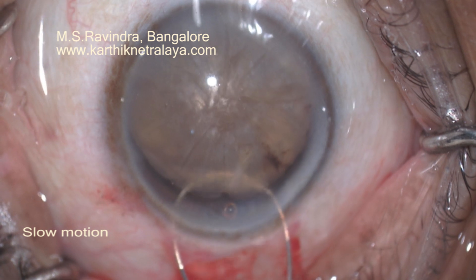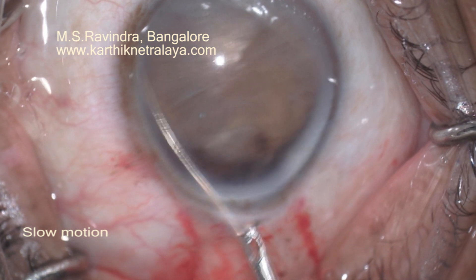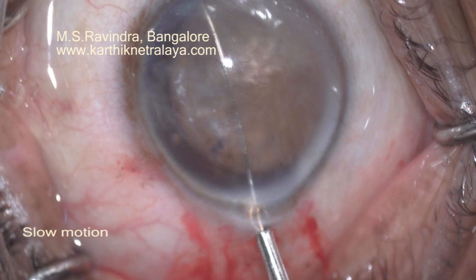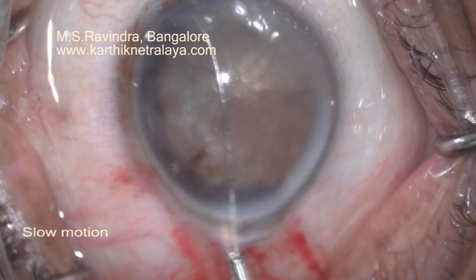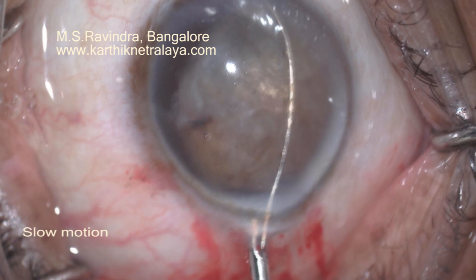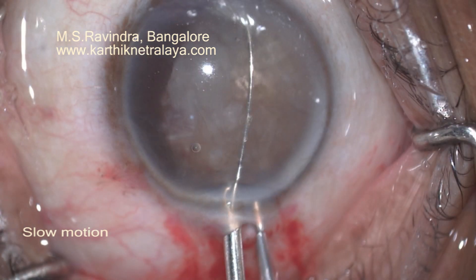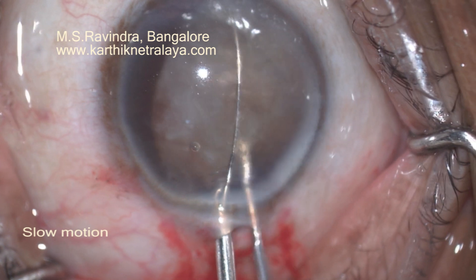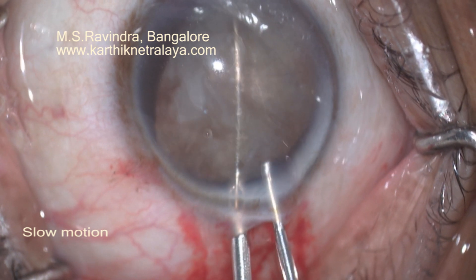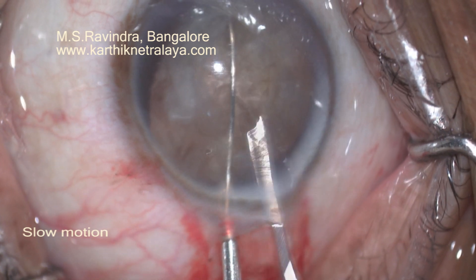I am taking the snare and bringing it to the front of the nucleus from its left pole. It's being maneuvered — I am rotating it clockwise until it comes to the center of the nucleus. Tightening the grip and adjusting it so that the two halves are exactly cut. Now the plane of the wire is exactly perpendicular to the plane of the lens.